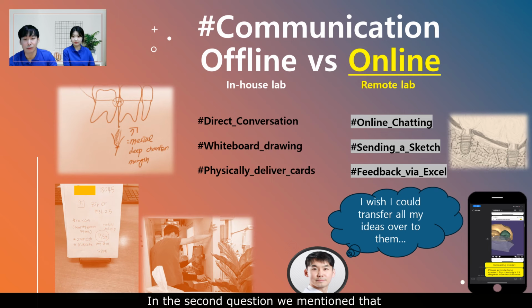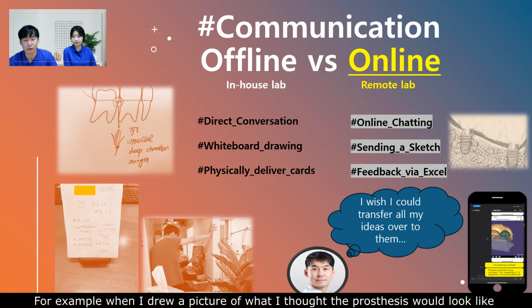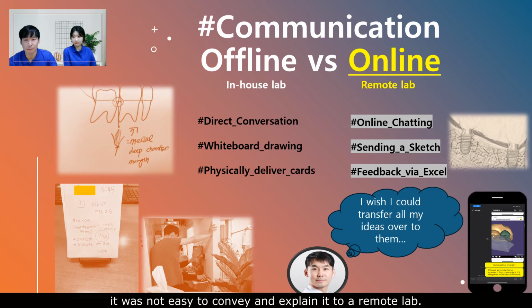In the second question, we mentioned that we give an evaluation report on process results in Excel files. But the problem is that there is no open line of communication or sufficient exchange between the dentist and the technician. For example, when I drew a picture of what I thought the prosthesis would look like, it was not easy to convey and explain it to a remote lab.